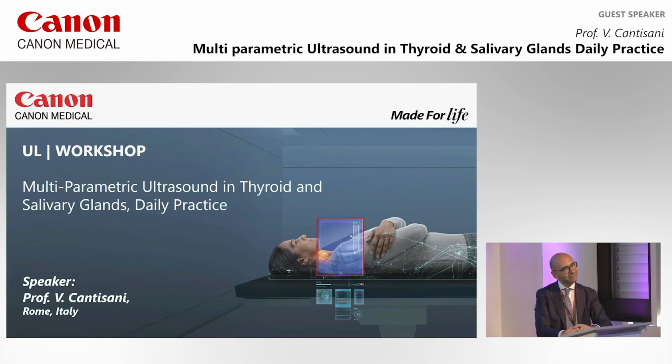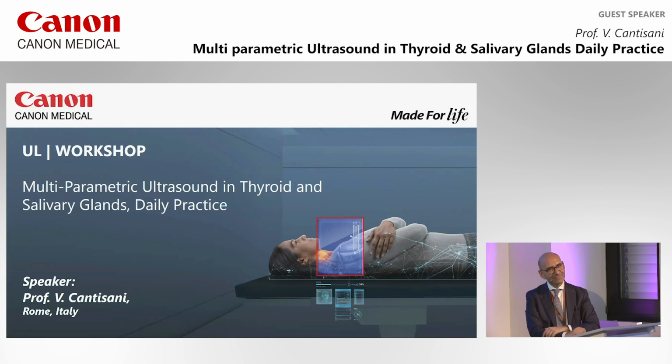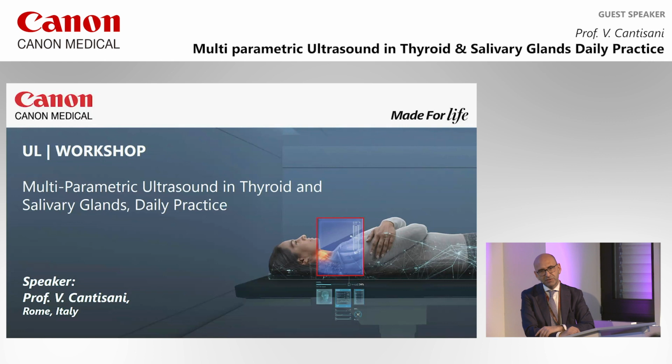Prego. Some more questions? Yes, here. Thank you for your presentation. My question is, if you find two lesions in a thyroid lobe, one not very suspicious, the other more suspicious, do you apply separately for each lesion all of this? Yes. Even if they are close together? I apply it to both, because sometimes, unfortunately, even the non-worrisome appearing lesion can be stiff. In that case, I suggest doing fine needle aspiration.